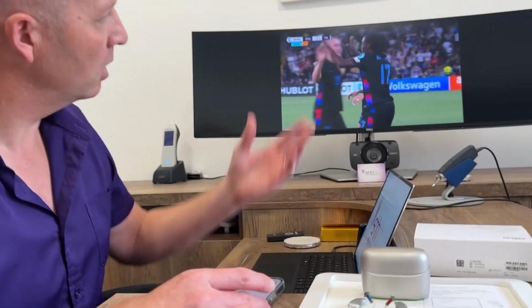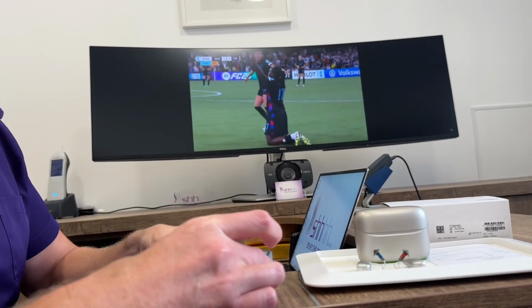There's two different ways your hearing aids can be set up to work with the TV connector. By default, if your audiologist hasn't made any changes, as soon as you turn the TV on, the sound of the TV will stream directly into your hearing aids. The other option, which is what I prefer 9 times out of 10, is to give you the ability so that you know when you want to listen through the TV. This stops any problems where your other half might go and switch the TV on. If it's on automatic and you're in range, like it or lump it, you're going to be listening to the TV. So in regard to this, we've got the TV on, we're all connected up onto the TV now.